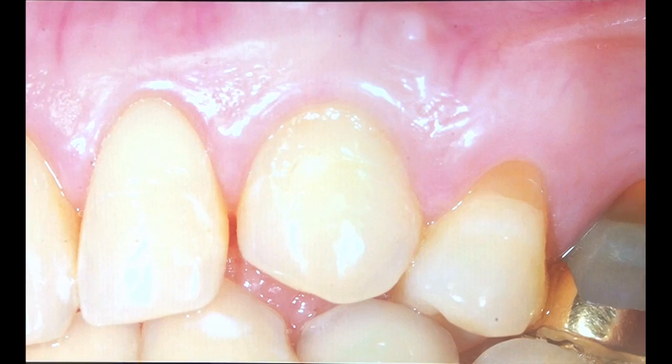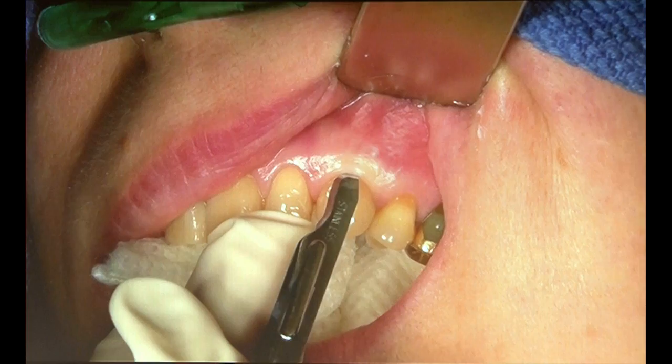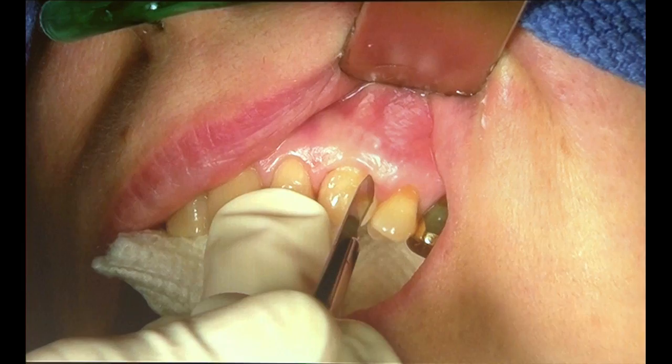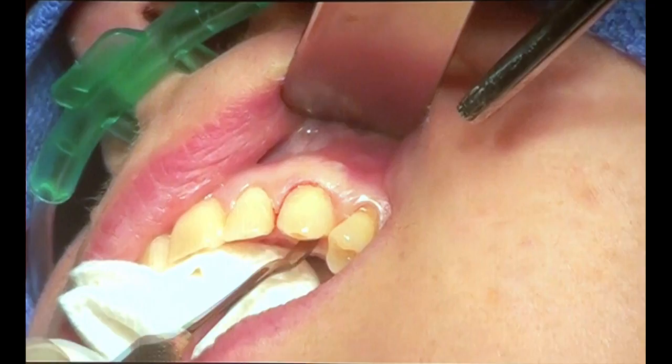The canine here has to be removed because of internal root resorption, and the patient was becoming symptomatic. And again, this patient's demand was for an immediate crown to be placed because of the location of this tooth being in the aesthetic zone and her needs to see her clients, her patients.